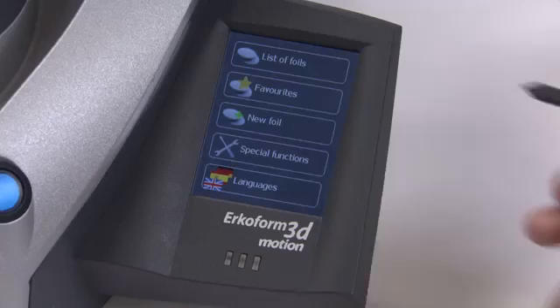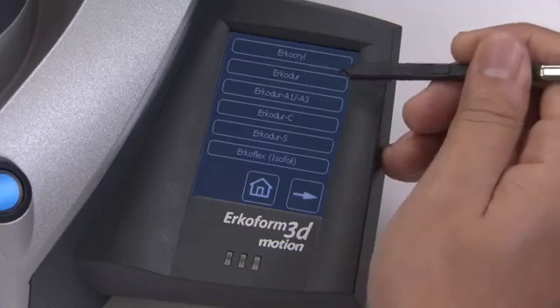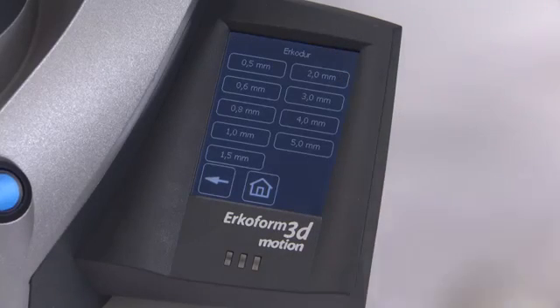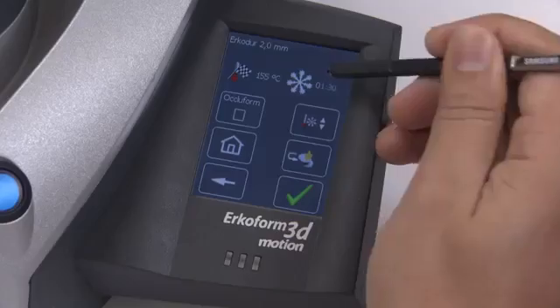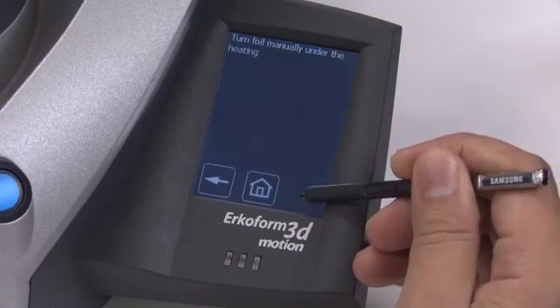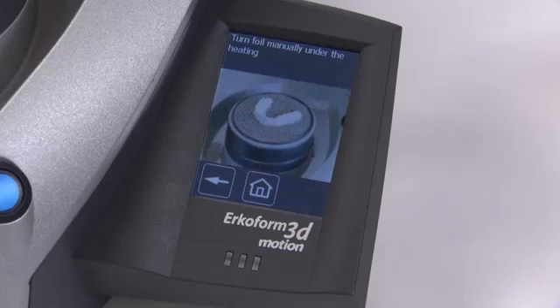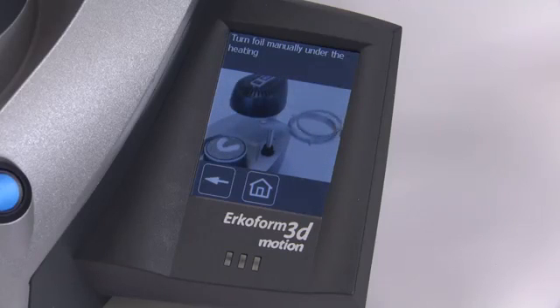Start the Erkoform 3D by pressing the List of Foils button. Select Erkodur. Select the 2mm material. Verify the heat temperature and the cool-down time. Tap the green check mark to begin the program. The Erkoform 3D will show you a quick video explaining the next steps.